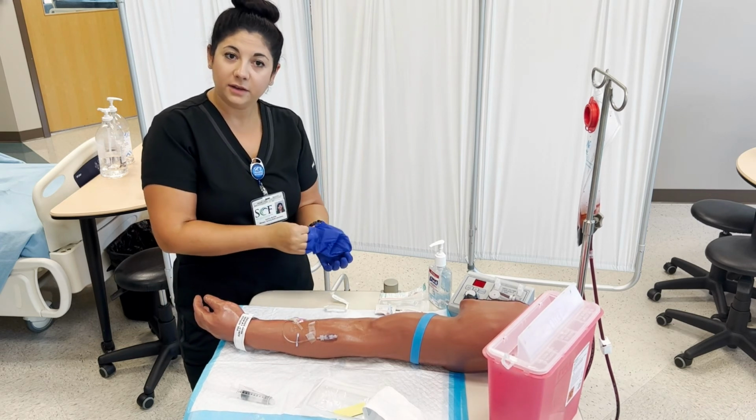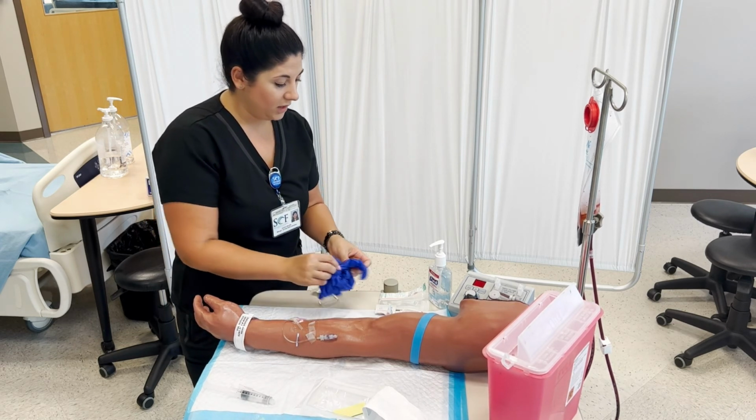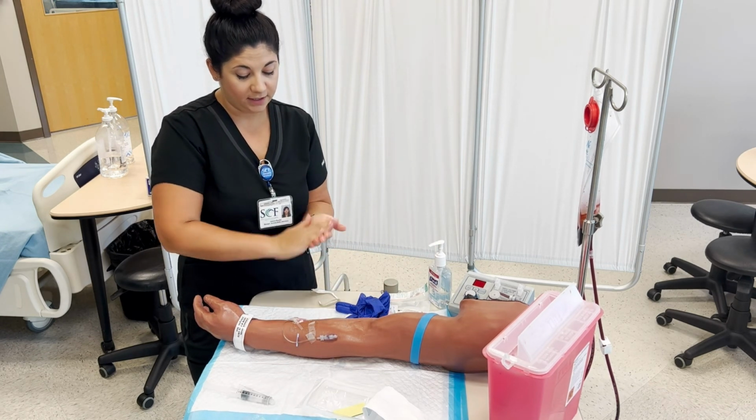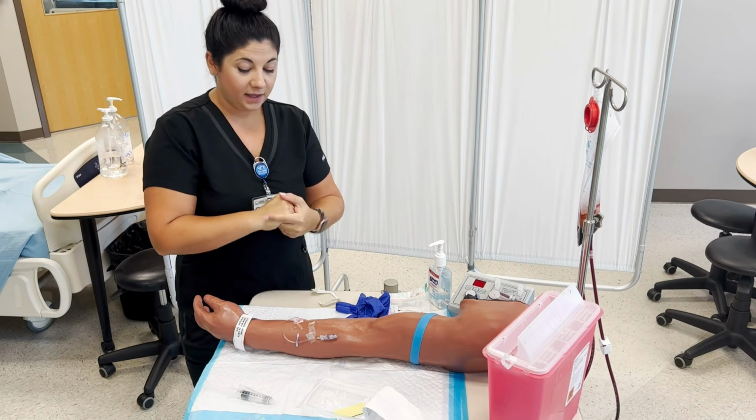I will take off my gloves, wash my hands, clean up my area, document the location and the size of the IV gauge and how my patient tolerated it. And then we're done.